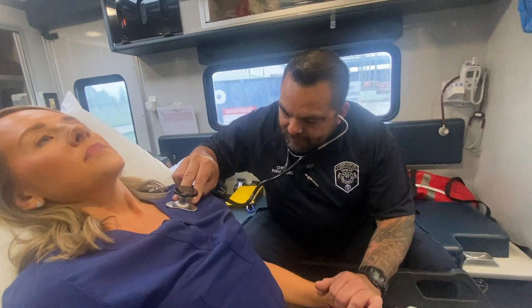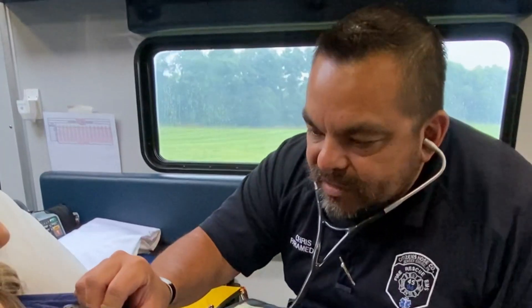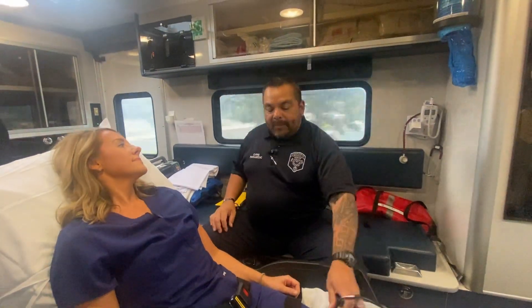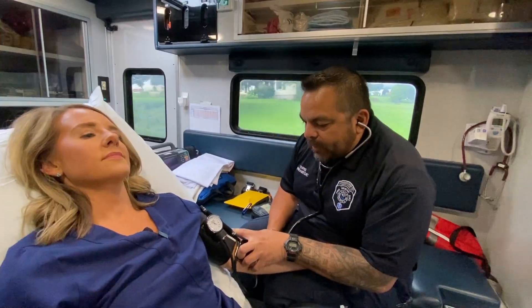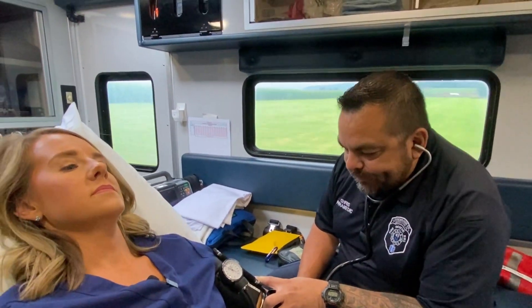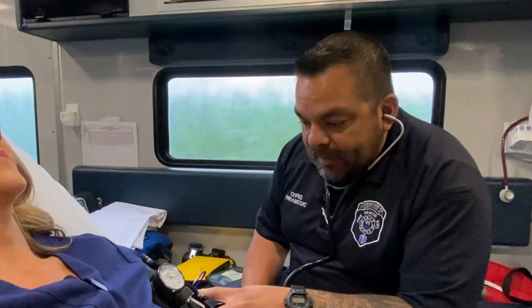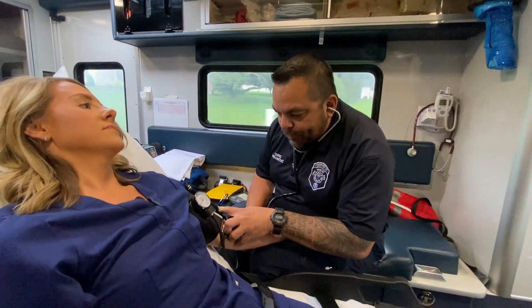Take a deep breath. Let it out. Deep breath. That noise cancelling feature is really nice. I'm going to loosen this belt a little bit just so I can listen to your lower abdomen. I'm going to grab a BP cuff. What's your normal pressure? About 105 over. So I'm way up. We don't take pressures like nurses do. I can hear this very clearly — I could not hear this with an analog stethoscope. That's awesome. We're going to leave that on because I'm going to take another pressure later on down the road.